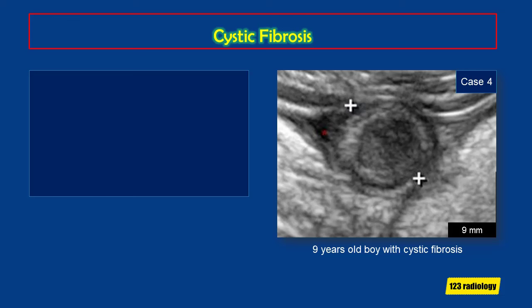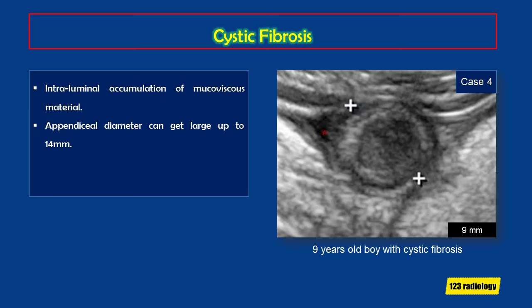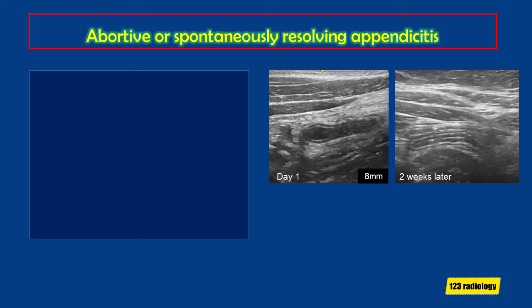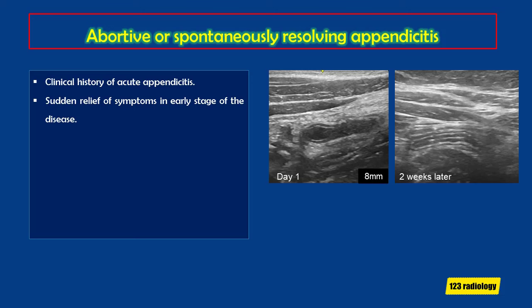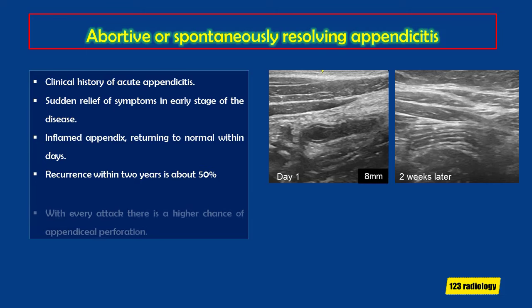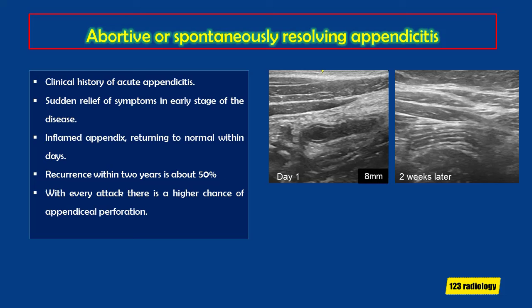In a 9-year-old boy with cystic fibrosis, the appendix is incidentally noted at 9 mm in diameter in the right lower abdomen. Similar to fecal distension, there is intraluminal accumulation of mucovisous material; the appendiceal diameter can reach up to 14 mm. The appendiceal wall and peri-appendiceal soft tissues are normal. Finally, abortive or spontaneously resolving appendicitis requires a clinical history of acute appendicitis with sudden relief of symptoms in early stage. Ultrasound shows an inflamed appendix returning to normal within days. Recurrence within 2 years is about 50%, and with every attack there is a higher chance of perforation — so the policy is immediate appendectomy even if symptom-free.